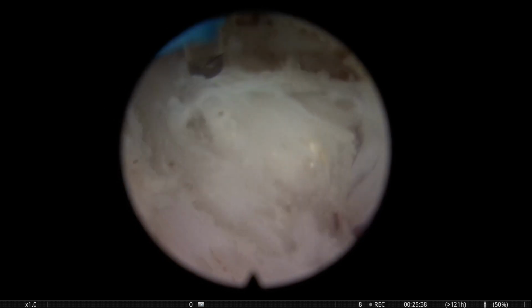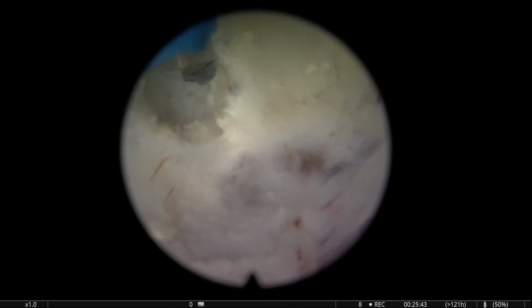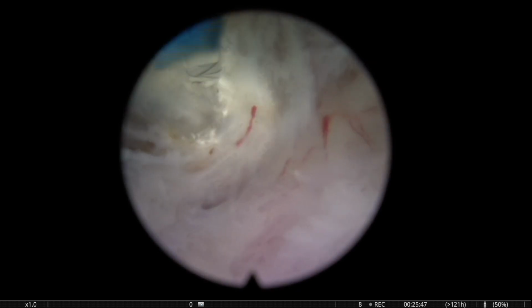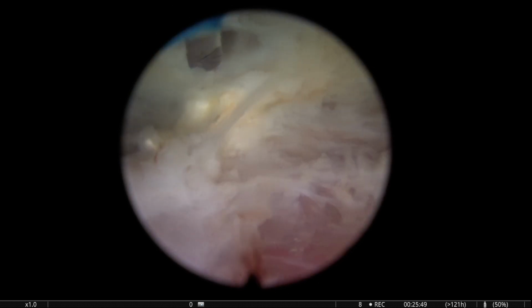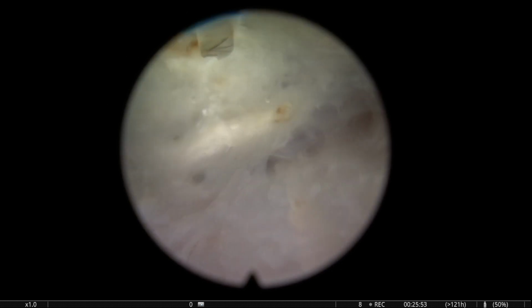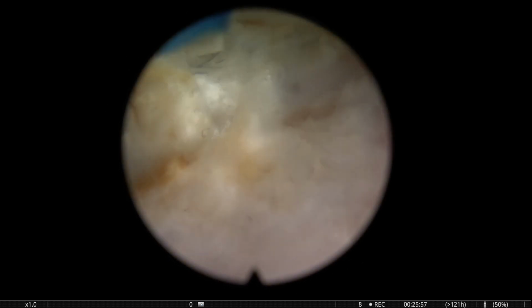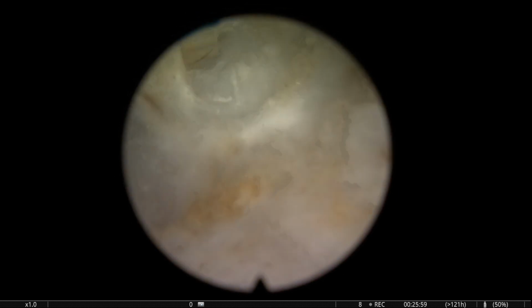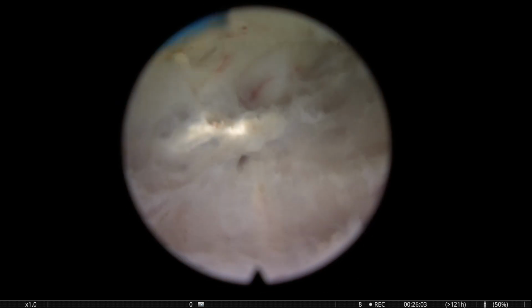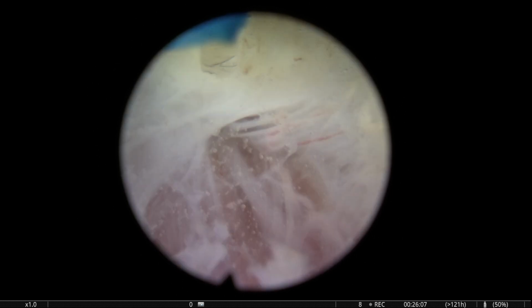I'm going out a little bit more now because I want to go deeper and remove this nodule. But of course, I have to use a very, very careful dissection energy so that it has a very soft effect on the tissue and is not very disruptive. Okay, and this is how you get the mastery of enucleation. You have to know how to use the energy, what distance, what speed, and of course, where you target the energy.